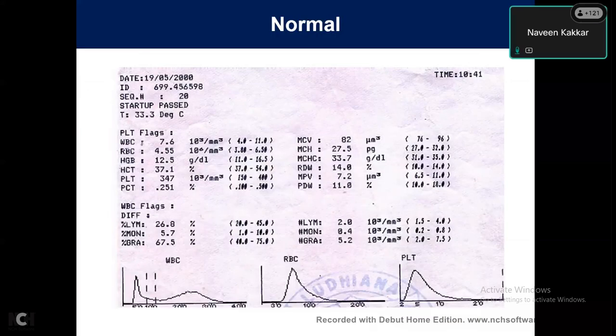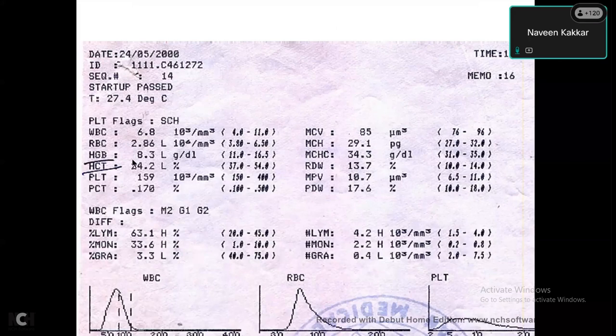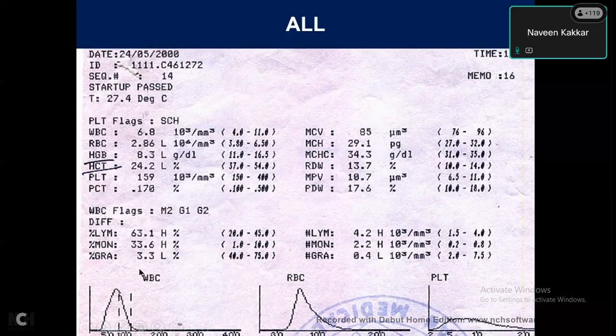And this is a case where we have anemia. The platelet count is on the lowest side, but still normal. TLC is normal. You have a single peak. So if you see the lymphocyte count rises in its zone, but it is falling in the mid zone and just touching the granulocyte zone. There is hardly any granulocytes here. So this single peak tells me there is an abnormal population there, and this was a case of ALL. Now, the mid zone, remember, has been elevated here. So the mid zone elevation, usually you would get monocytes, eosinophils, or atypical cells.